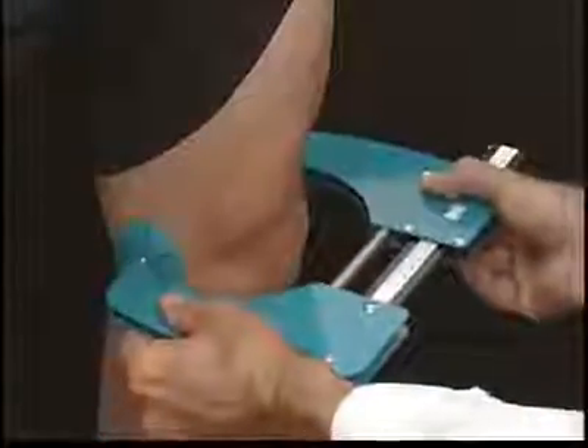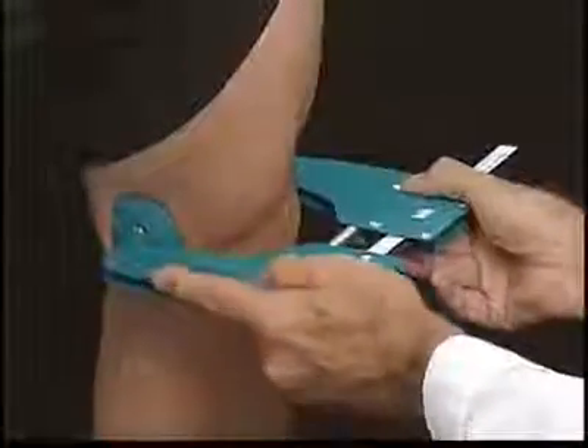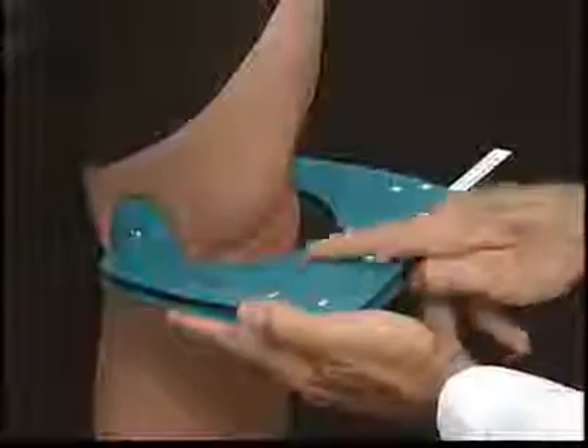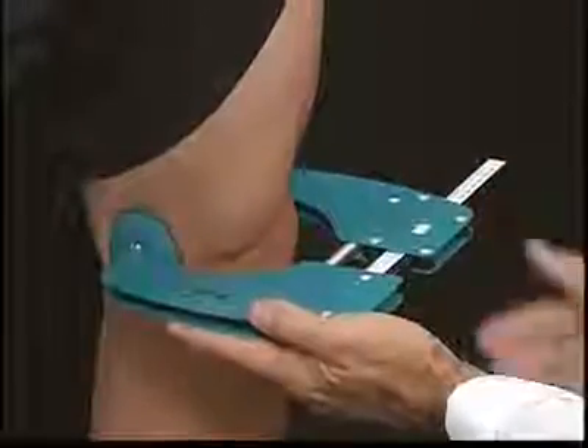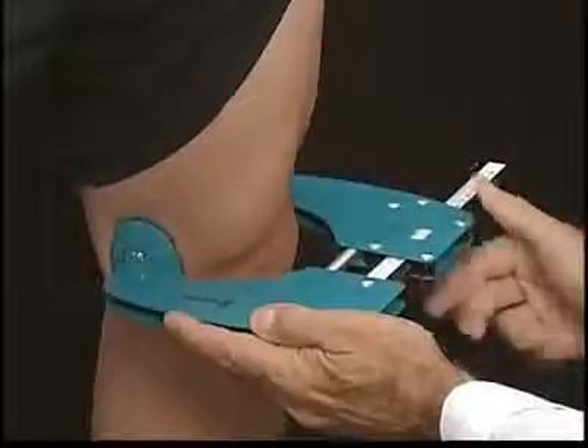Place the knee width gauge against the condyles. Make sure the baskets cover the condyles. The gauge is in the correct position when the top of the gauge lines up approximately with the top of the patella. Press in the gauge slightly to get your knee width measurement.